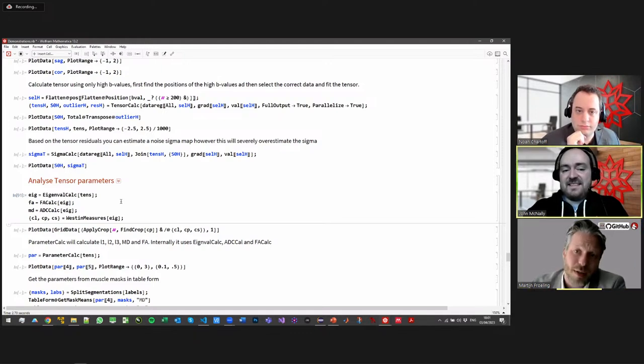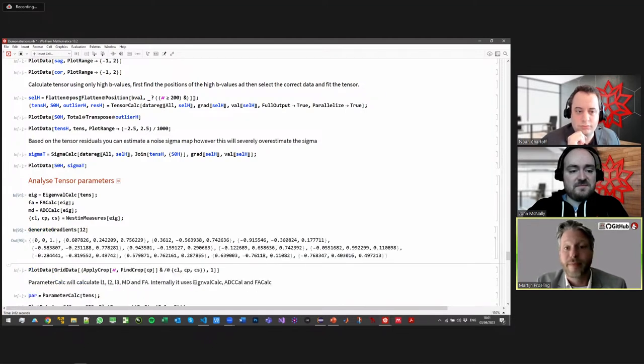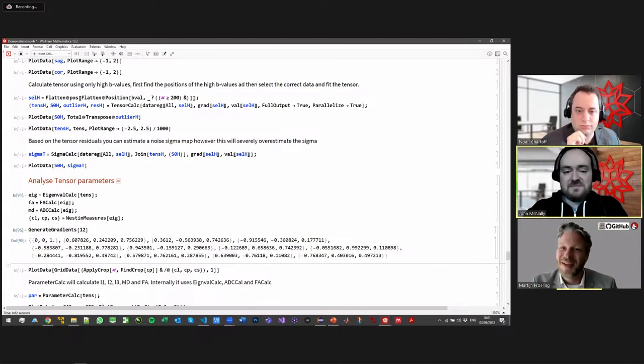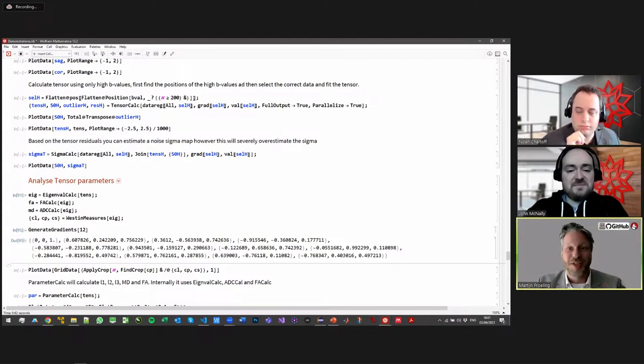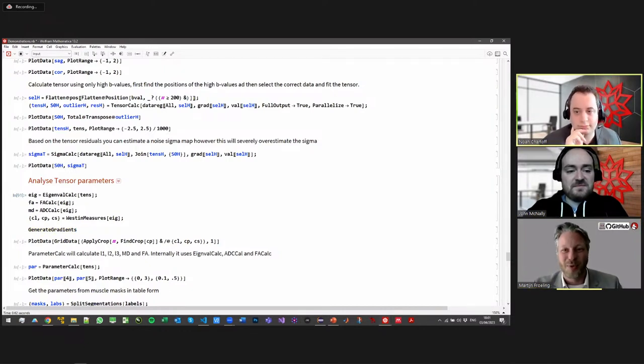So the one I showed, this is the GUI version of this. This is basically just saying, I want 12, just go. This is how I use it. All that fancy visualization is nice for demonstration purposes, but it becomes slow, and it's actually quite a lot of work. I actually tried to make this GUI work, for example, in the cloud, but you need so many dependent functions and visualization stuff.